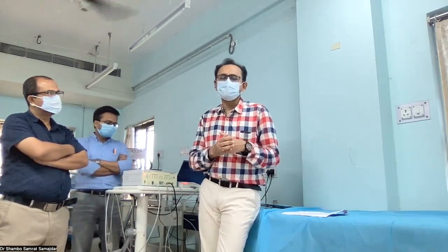First of all, we tell our patient to lie down here, or they can sit, and we attach the ECG leads. Specifically, we need to see lead 2, a long lead 2 ECG. First we tell them to breathe normally, and we take a baseline ECG. Then we tell the patient to blow at 40 millimeters of mercury pressure for 15 seconds. And then after 15 seconds, they will stop blowing.